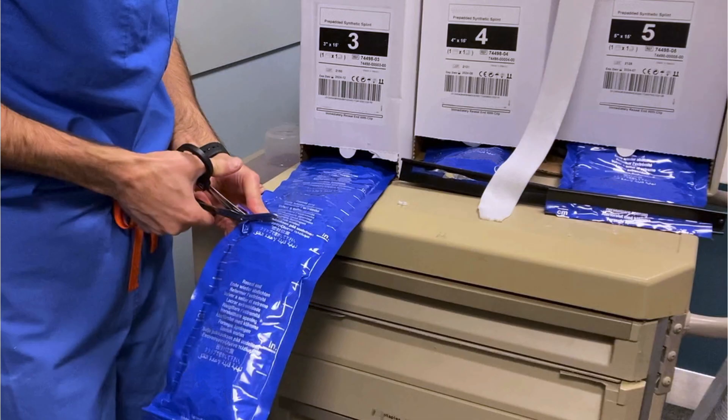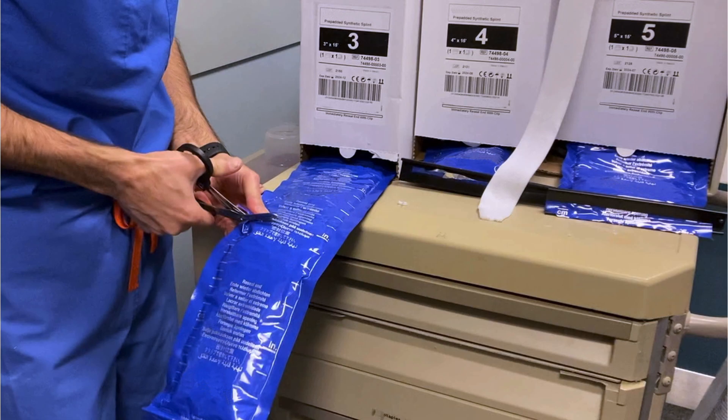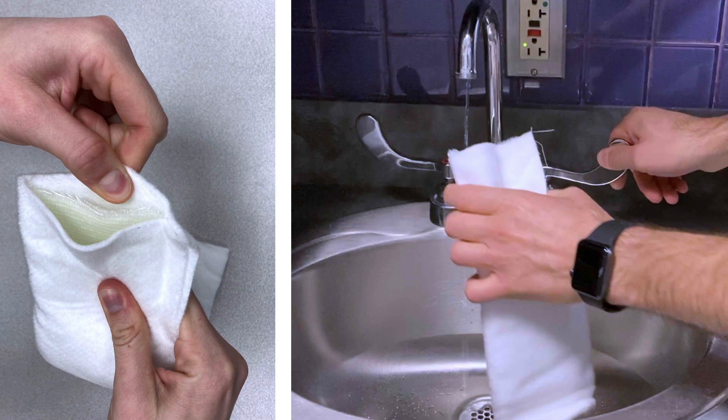Fiberglass also comes in a variety of sizes depending on width, so first you'll have to select the correct size. After you cut it to the desired length and remove it from the airtight packaging, the fiberglass activates with the moisture in the air, or even with a small amount of water that you can add from a tap. It's going to harden in minutes and become warm in the process.